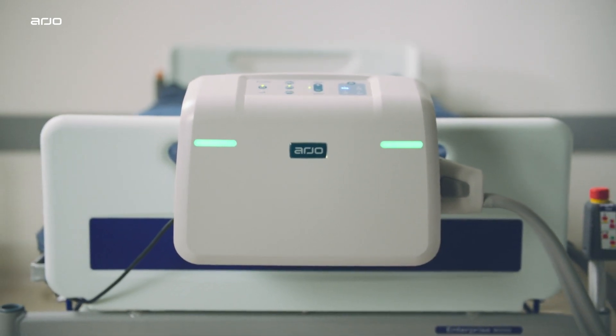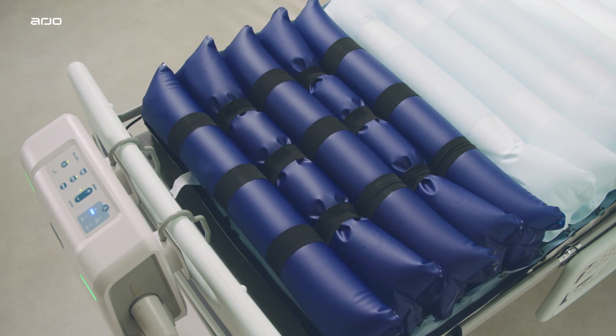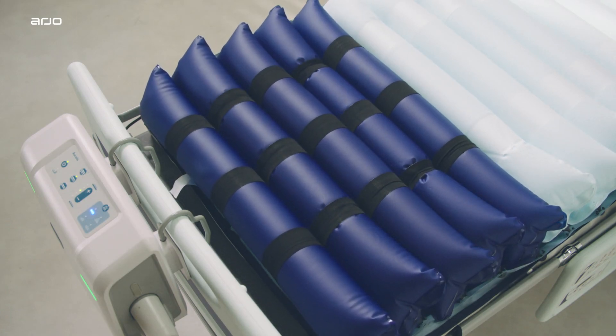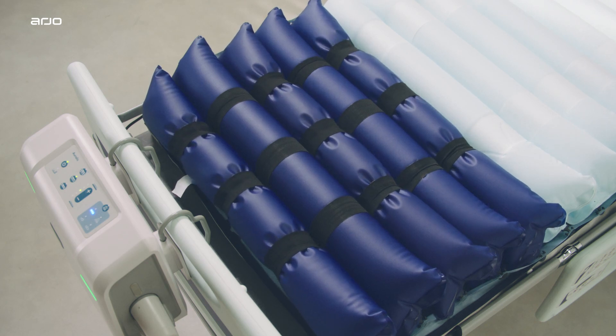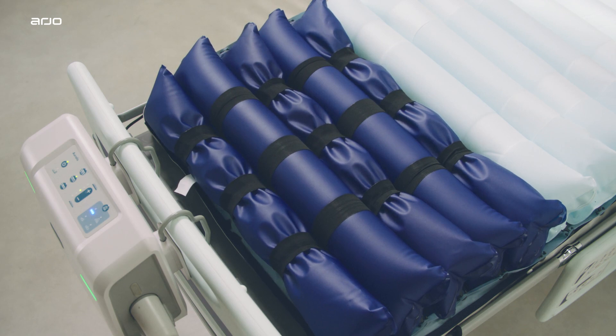Designed especially for high-risk and vulnerable patients, Oralis uses Arjo automated alternating pressure therapy for round-the-clock pressure area management when combined with an individualized monitoring, repositioning and wound care program.